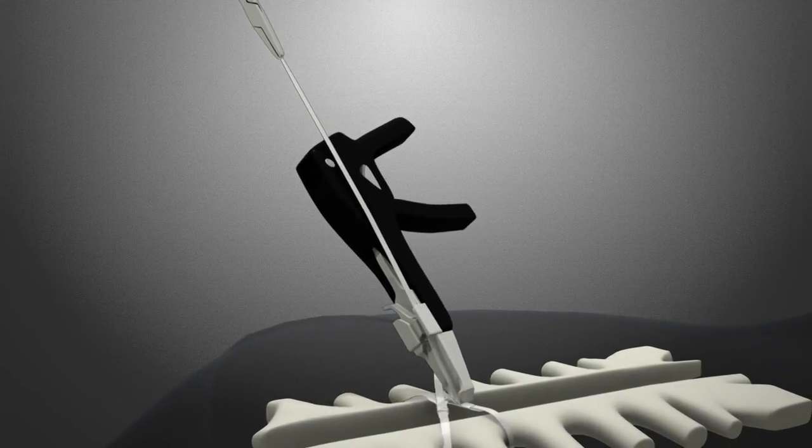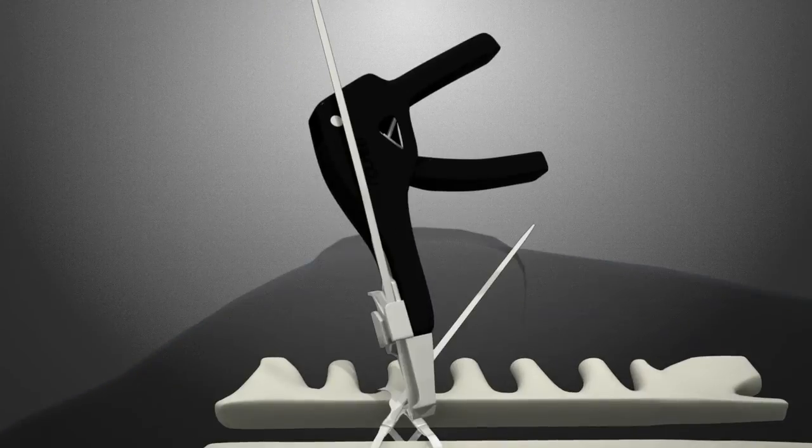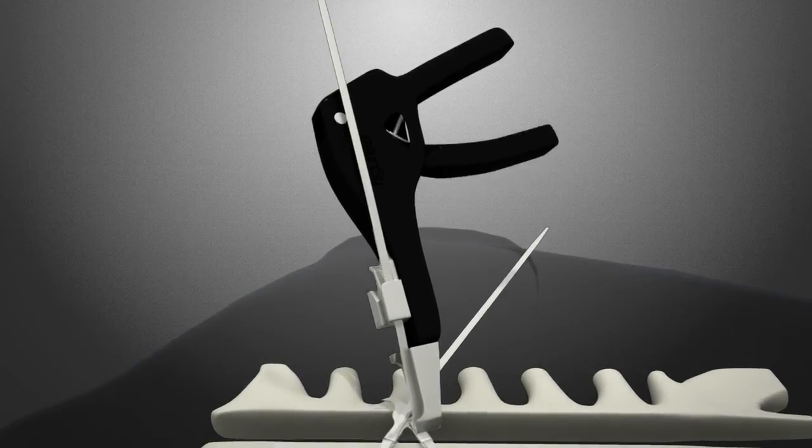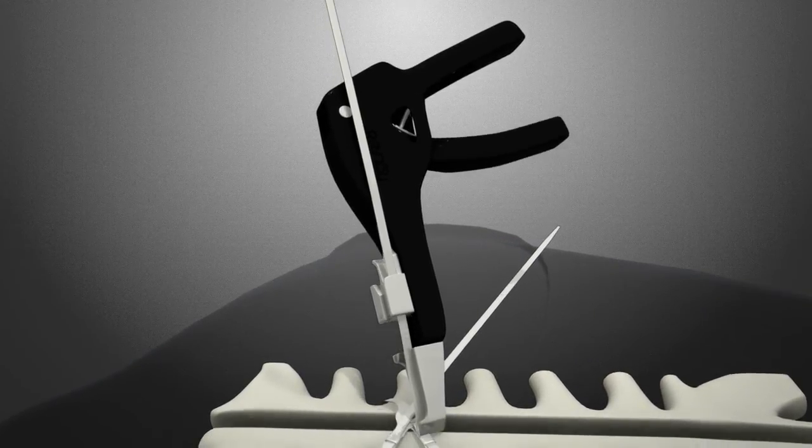The tool handle is ratcheted repeatedly until the strap begins to tighten on the sternum, bringing the two halves together.